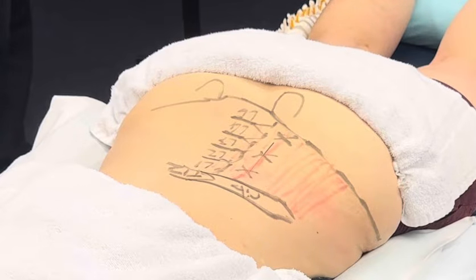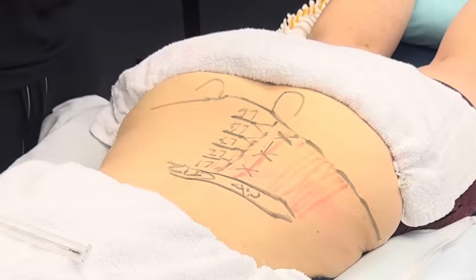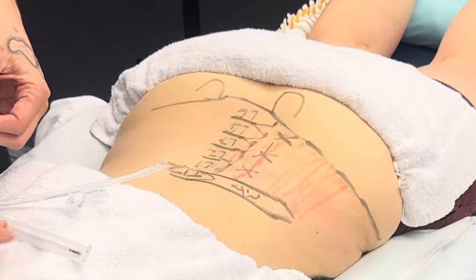If you need me to take out any of the needles, if any of the needles are too intense, you just tell me and I can take it out. It's another reason why I don't leave needles in there. You can, it's fine, but just use the same needle and keep going, right? But for demonstration purposes, we can do one more paraspinal, and then we'll do QL.